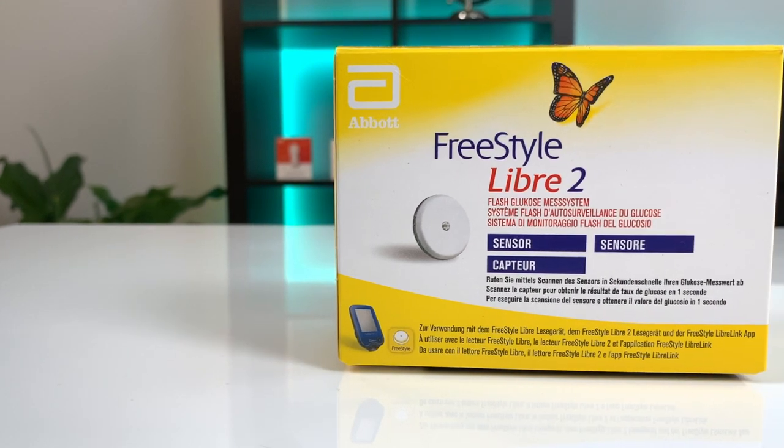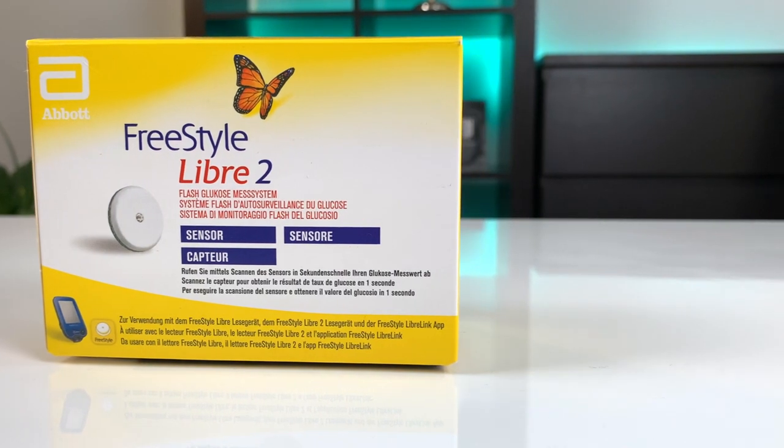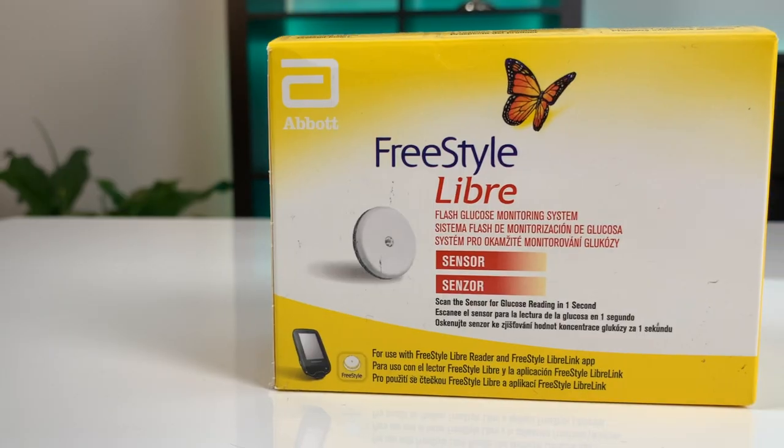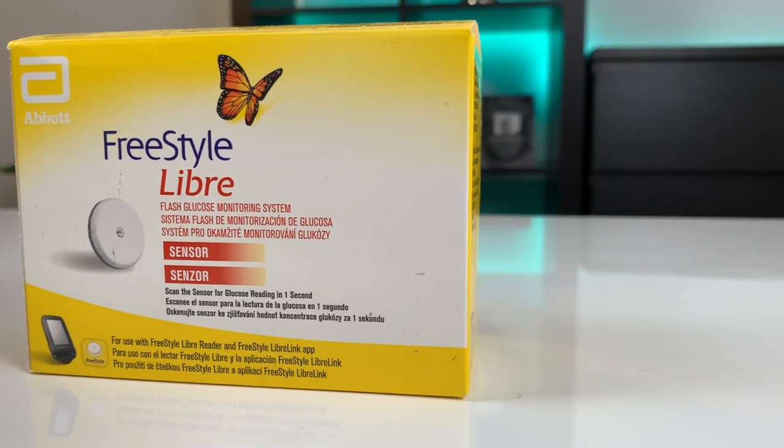Step 1: find out what Freestyle Libre version you are using — it's written on the package. Alarms is a new functionality that Abbott introduced only for the Libre 2 sensors, the second generation. But if you have an older version like Libre 1 or Libre 14 days, wait for the second half of this video where I will show you a little trick how you can get alarms on Libre 1, Libre 14 days, and all the other older versions.